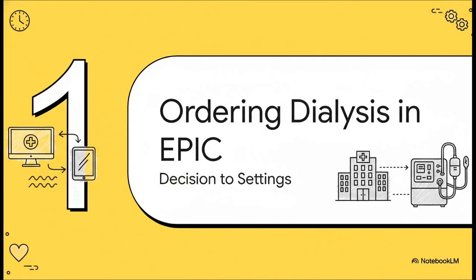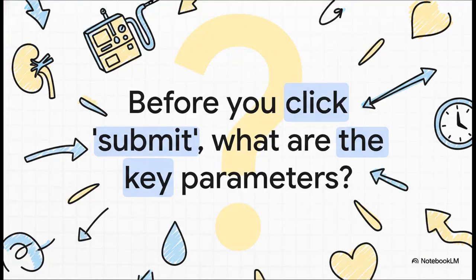Okay, so the whole thing really starts on the computer. Before Mr. Lim even gets to the dialysis unit, you have to place the order in our Epic system. And this isn't just some administrative task. This is where you, as the doctor, set the entire prescription for his treatment. This is really where your clinical judgment kicks in.